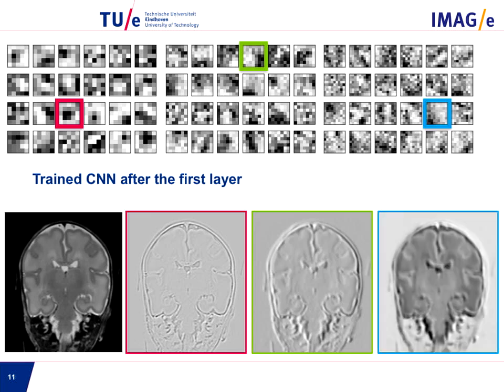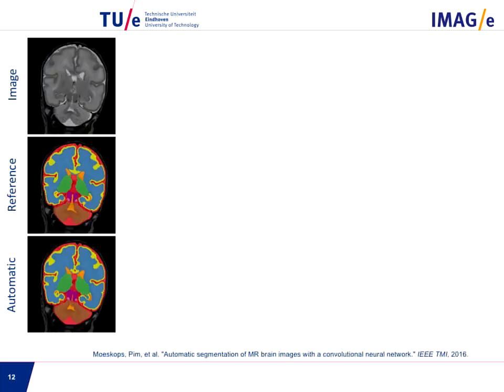And here this seems to invert the intensity. So you can see now that the gray matter is bright and the white matter is actually dark compared to the original T2-weighted image over there. So let's look at some results of this approach.